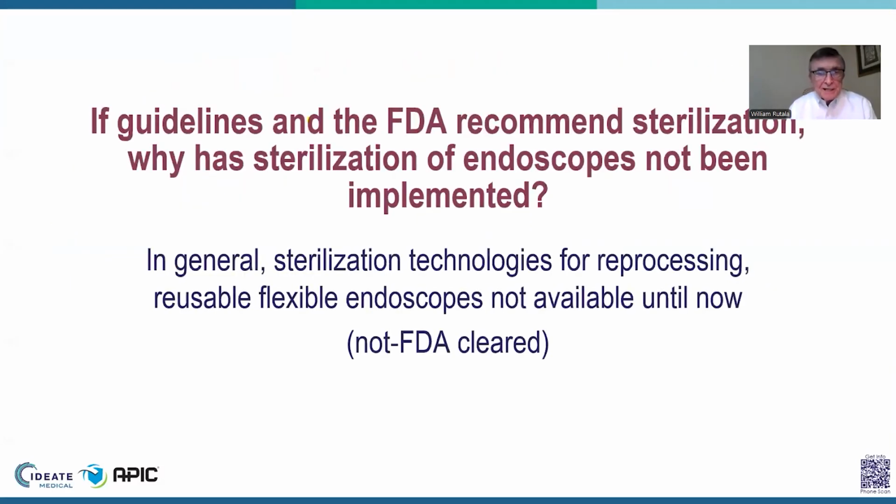In the next slide, essentially, we see in general the issue that although we've had guidelines and although we've had recommendations from the FDA, why has sterilization of endoscopes not been implemented? Well, the bottom line is, in general, sterilization technologies for reprocessing reusable flexible endoscopes has not been available until now.